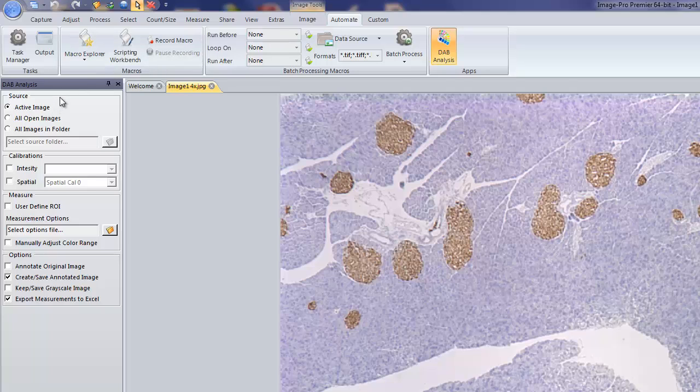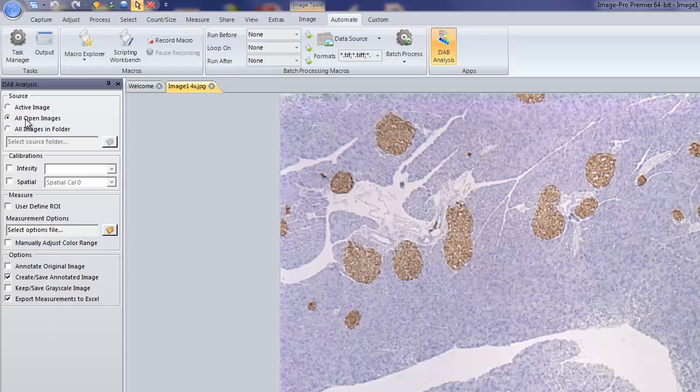From here, we can actually do a number of things. We can work with the active image. In this case, I have an image already open. If I have a series of images open on the desktop, I can work with all of the open images.